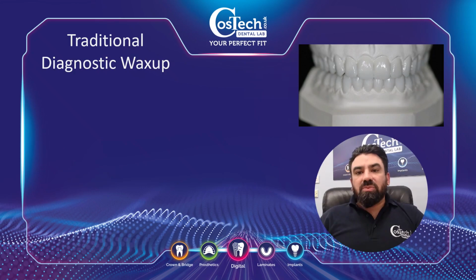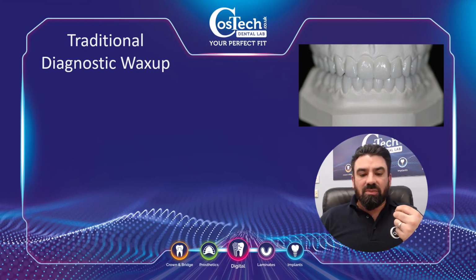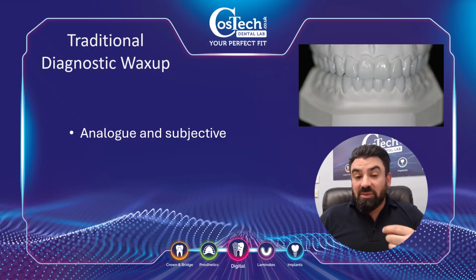So a lot of people have been asking, why did we stop doing the traditional diagnostic wax-up? It's been a staple for many, many years. But basically, with the invention of a lot of the digital technologies that we have, we found that it became very analog and subjective when we were doing it by hand. Technicians did it a lot by feel, with articulators and articulating paper just to check excursions and things. But again, it wasn't as accurate as we would like it to be.